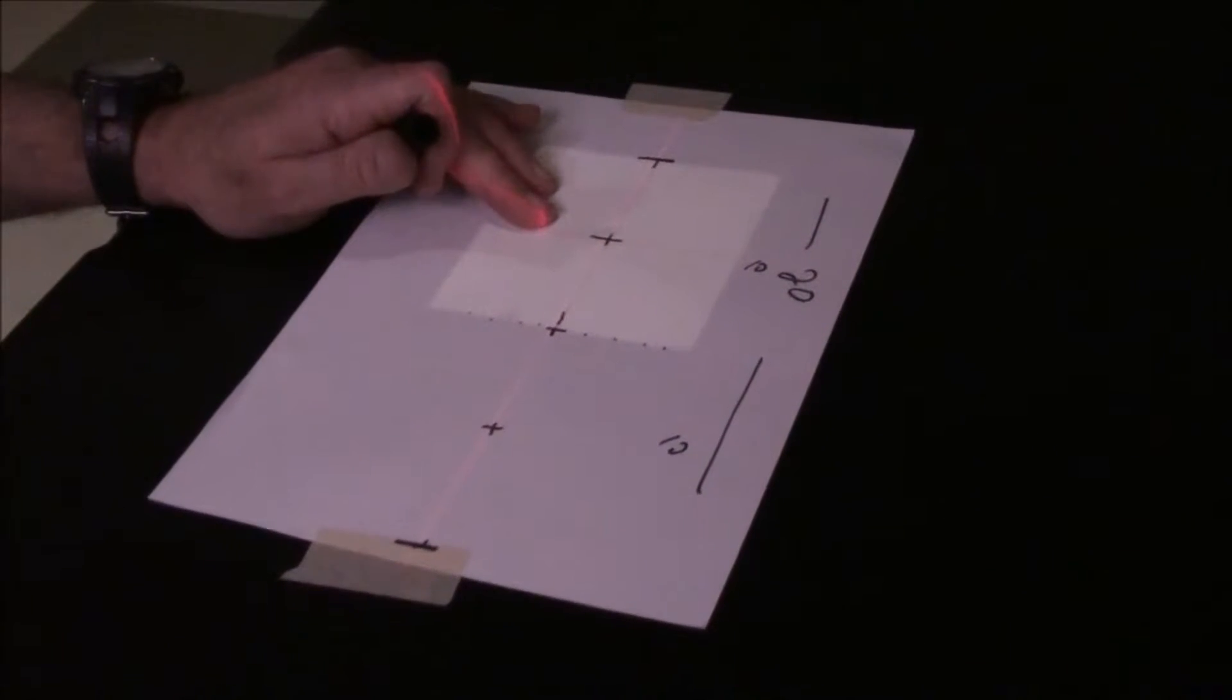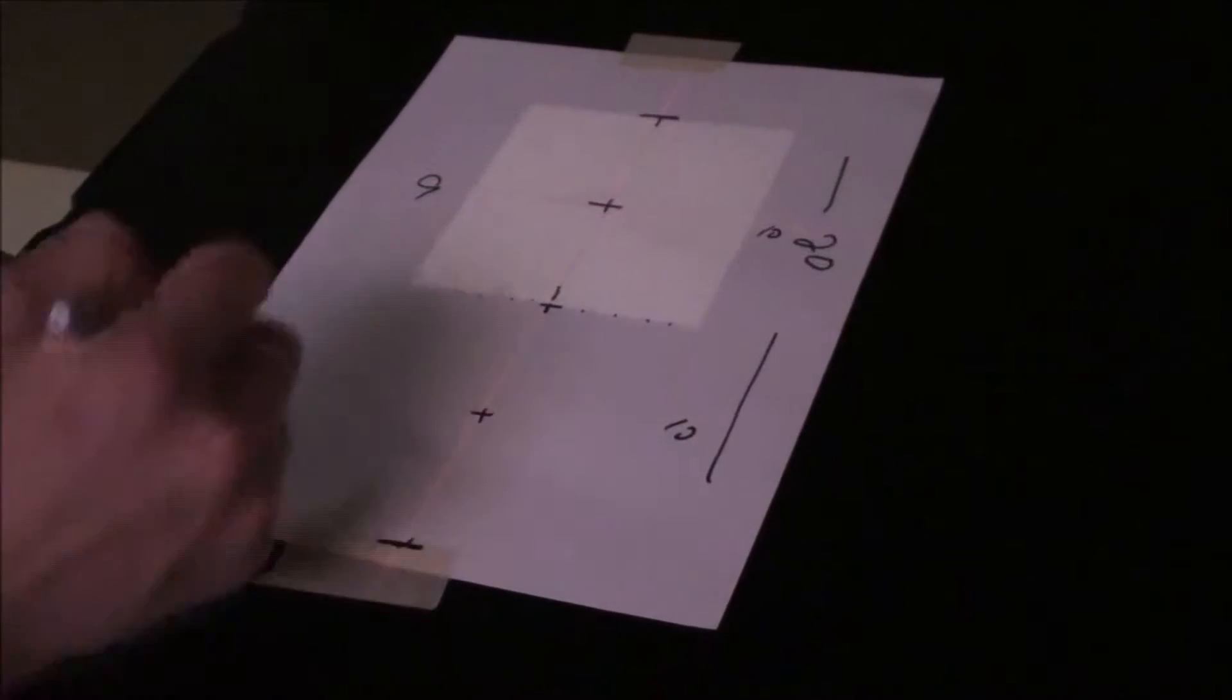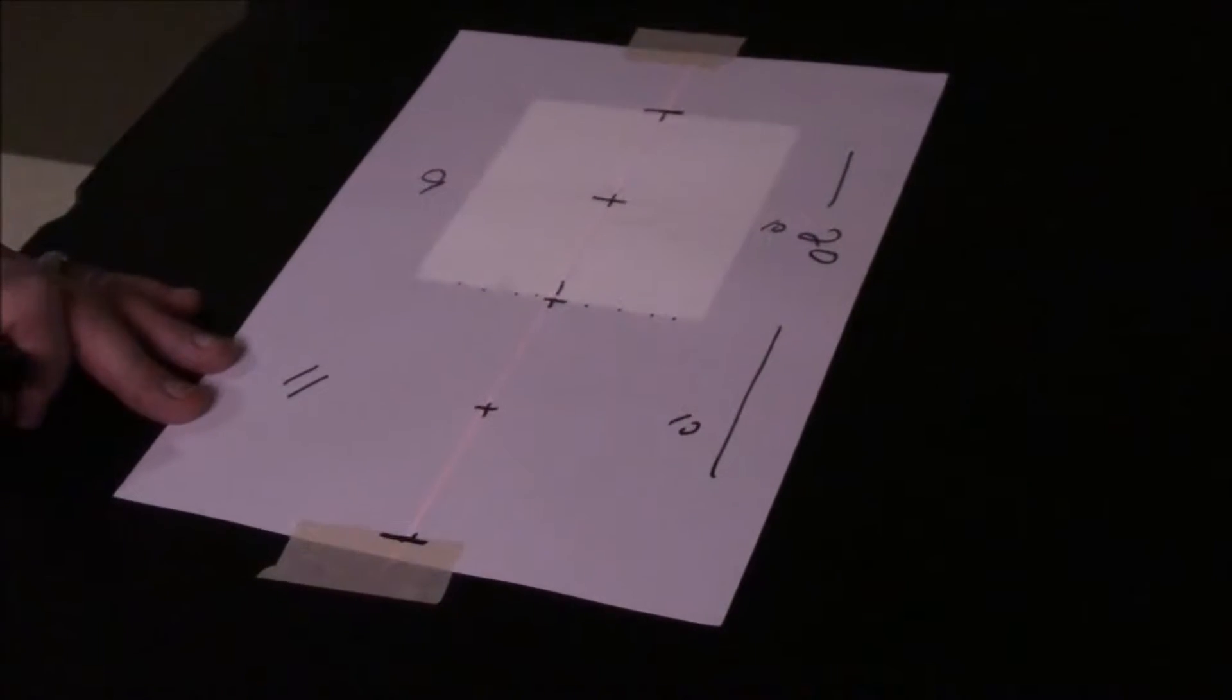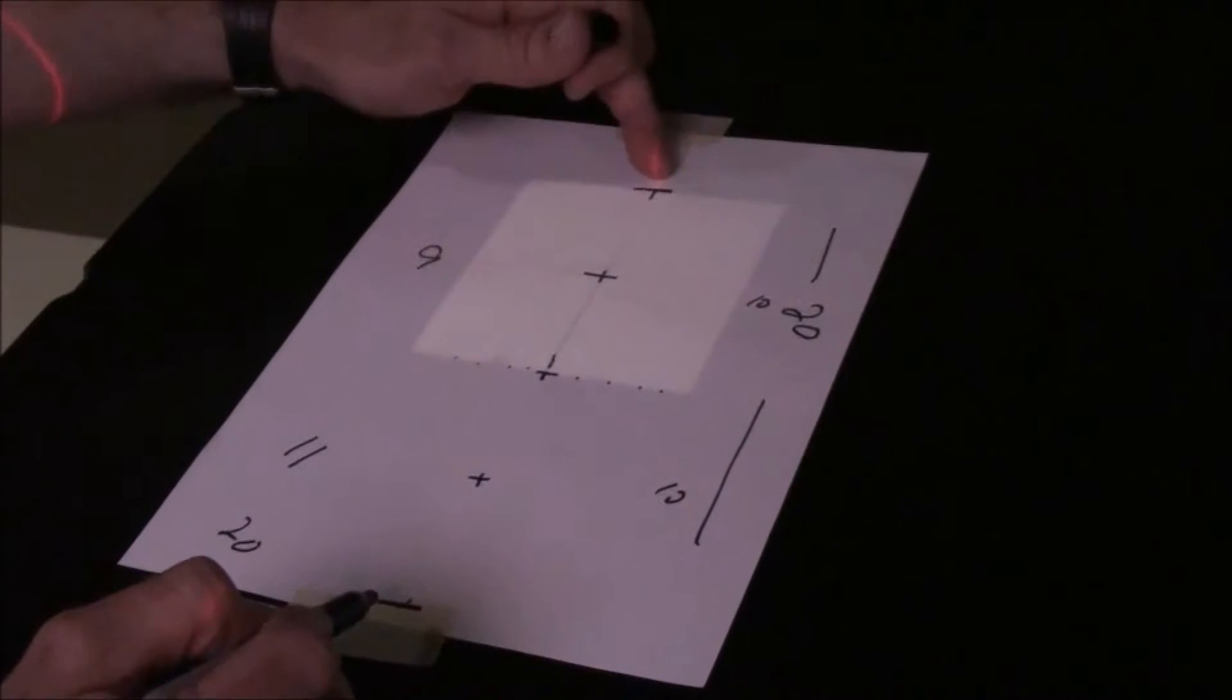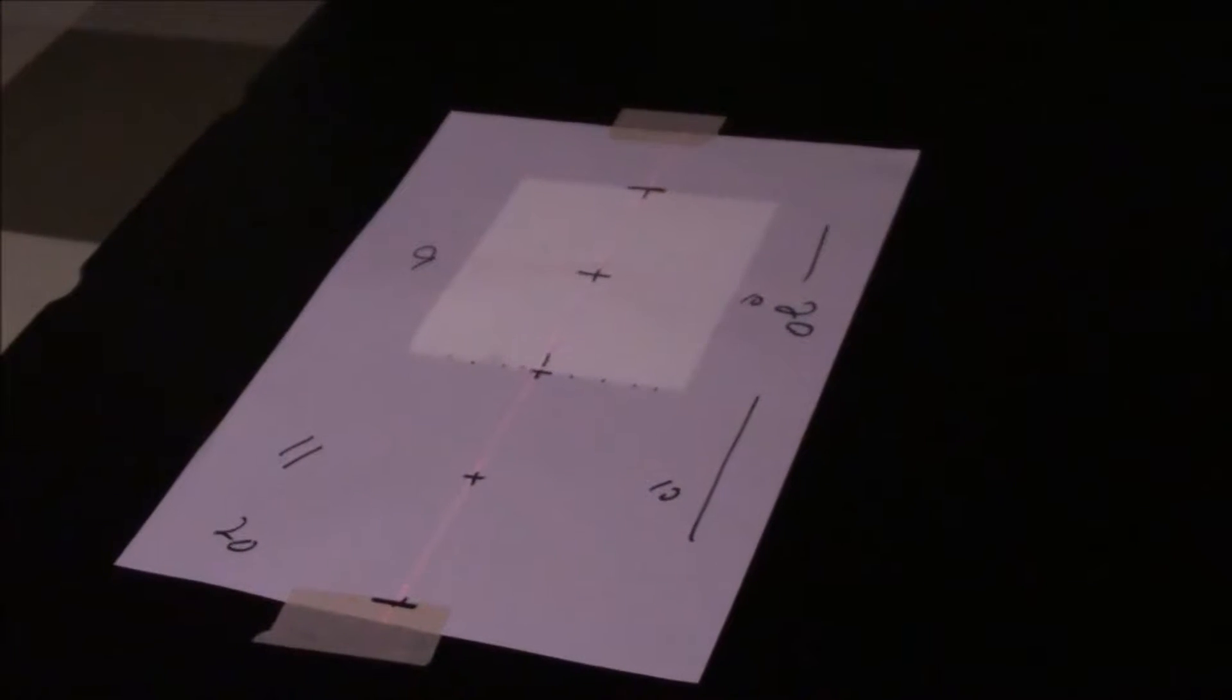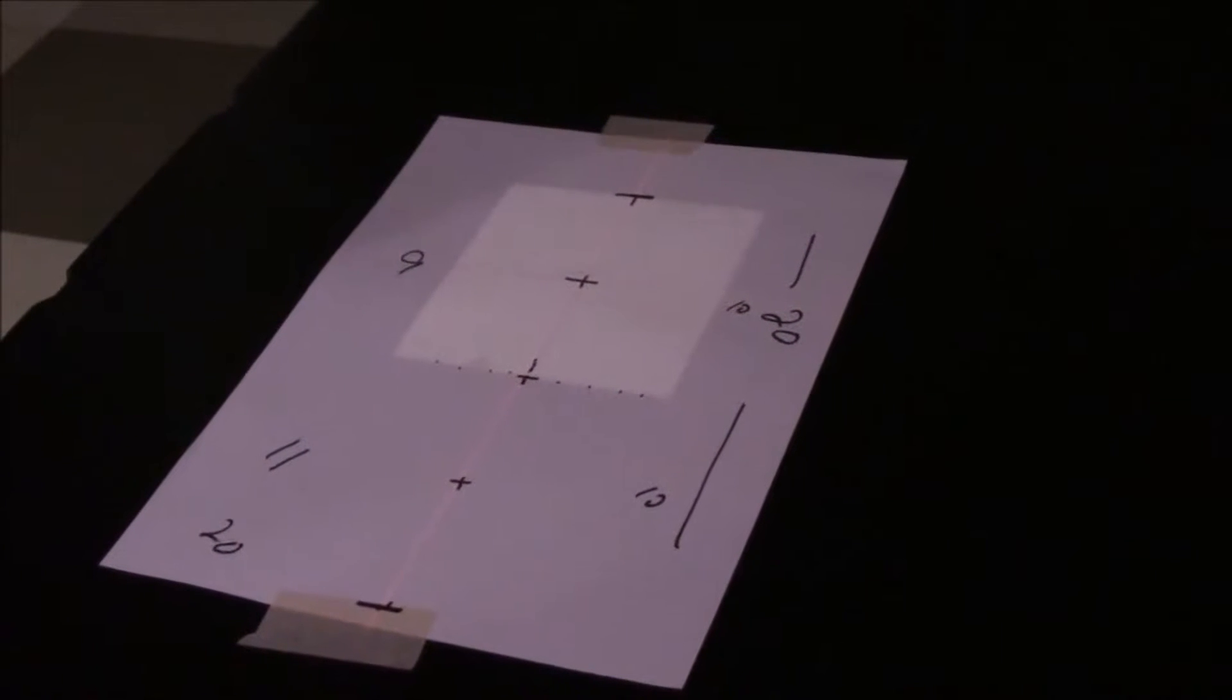We currently have 10 by 10. We're going to make the superior field 9, and we're going to make the inferior field 11, which still gives us 20 centimeters, which still means this field and this field edge will match. So I'm just going to move. The length will now become 9.